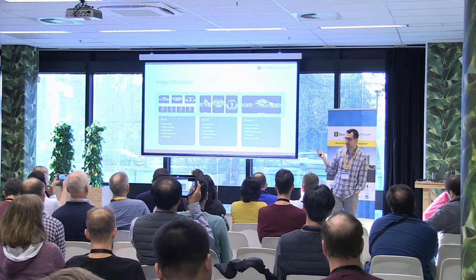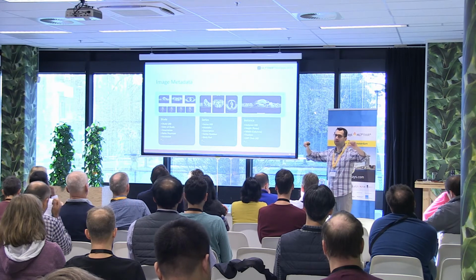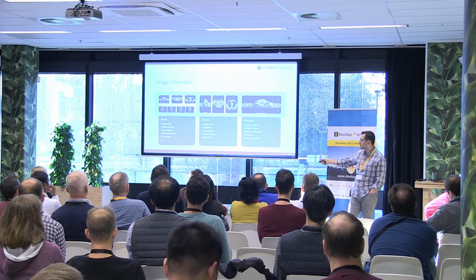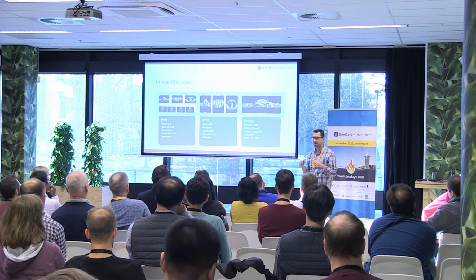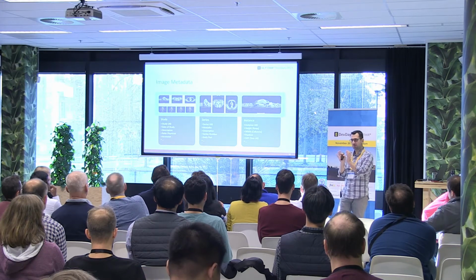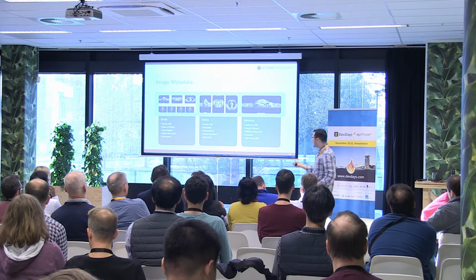Now, the unique IDs here use a slightly older format than we are used to seeing in FHIR. So it's usually a bunch of numbers separated by dots. Almost looks like an IP address, but a lot longer. You'll capture things like the study date, description, who the referring physician was, and then something called the accession number. So the accession number is usually an identifier, but that's a human readable identifier. It's not always guaranteed to be unique, whereas the first one we saw, the study UID, is always guaranteed to be unique. Of course, guaranteed to be unique within a hospital system. If you look at multiple hospital systems, you may get collisions, and then you figure it out with different methodologies.